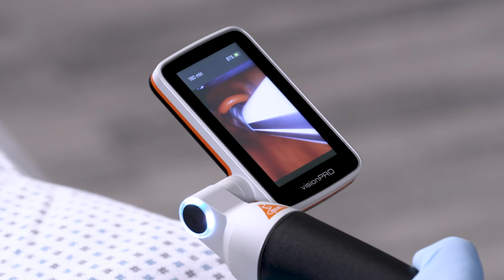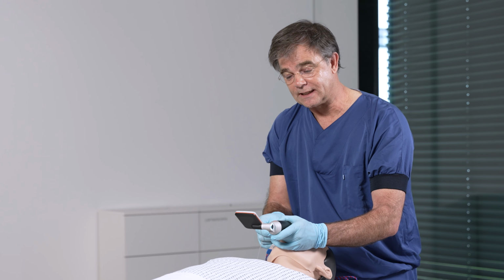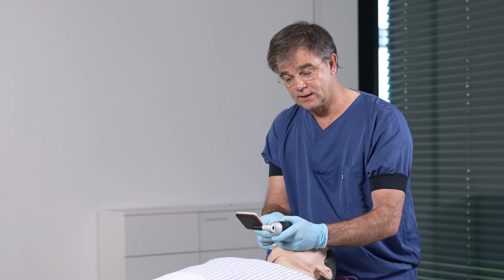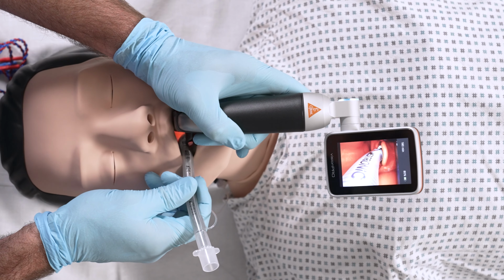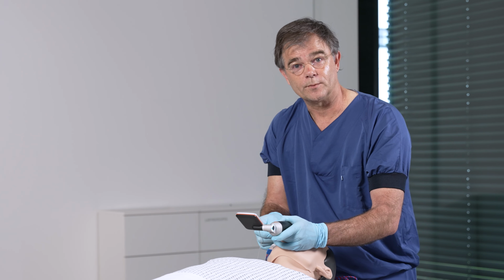So this will be a happy surgeon, a happy patient, and a happy me, because we need to do 3 or 4 patients in a day. And this is smoothly, correctly, and there's no issue at all with intubation. So when I place my tube, I would use a video laryngoscope. This is how it is done.